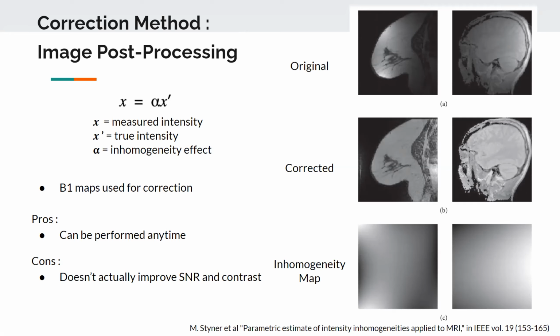And then adiabatic pulses, which I don't believe I've seen here, as well as another technique that has been traditionally used to mitigate this with the inversion pulses, which are completely insensitive to B1 inhomogeneity, except that they only depend on power. So you have to inject a lot of power in order to do that. But that's kind of always the trade-off. There's always a trade-off between things. So if you want to be robust at something, you have to invest something, and that's a limited resource like power. So that increases SAR.